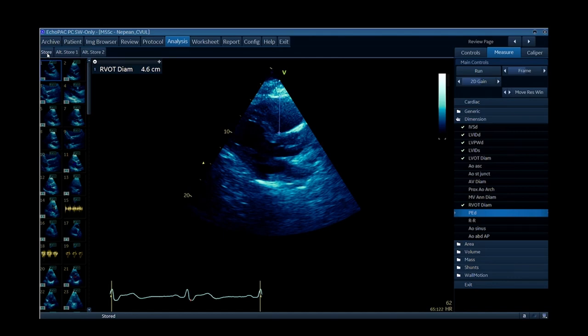From the parasternal long axis view you can tilt the tail of the probe up to get the RV inflow view, and tilt it down to get the RV outflow view. The RV inflow view is the nicest image for looking at the tricuspid valve on TTE — you can get really beautiful images there, and you also get nice Doppler alignment for that view.